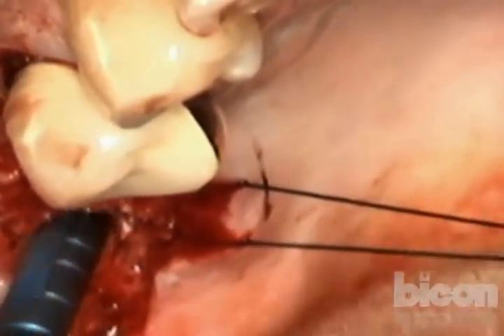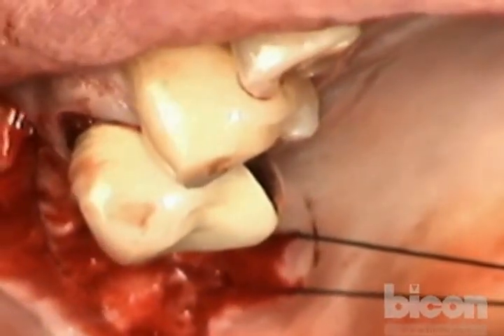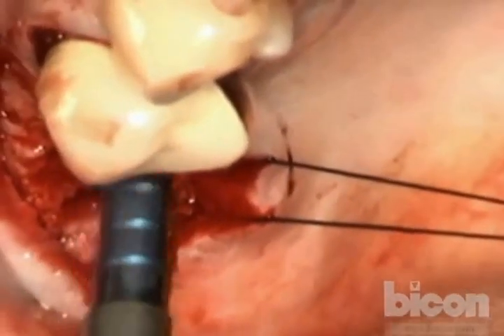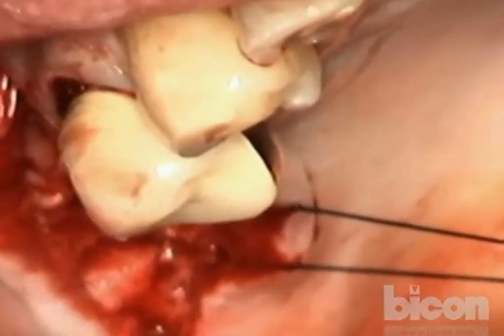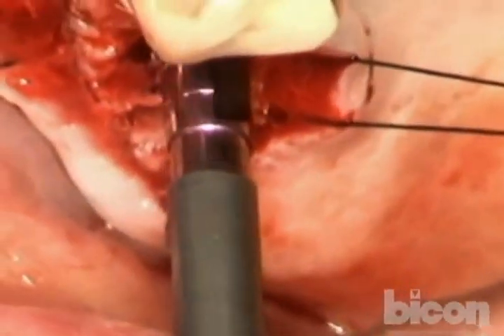The idea, I want that little bridge of bone to sort of be obliterated. Okay, clean that. And we go now to the anterior part, and that is wide enough. And we go to the 4. And now we should be able to get some friction on both. Chin up a little bit. Good.